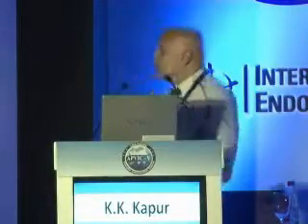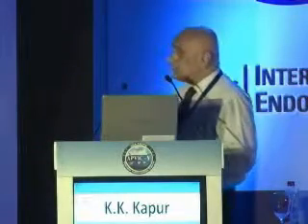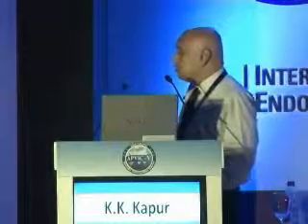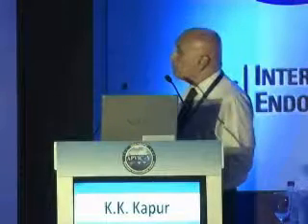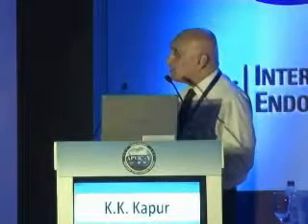Some compression could be possible in the acute DVT because the clot is extremely soft, but in a chronic DVT it is incompressible. You can get the thrombus tail in the lumen, and the clot could be adherent around the vein in the case of a chronic DVT, and absent or minimal collateral channels in acute DVT and prominent collateral channels in a chronic DVT.